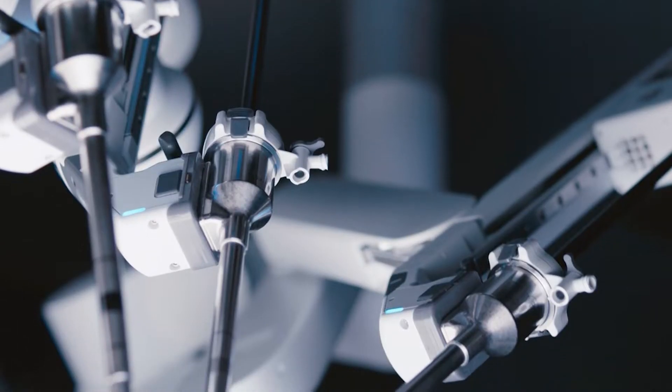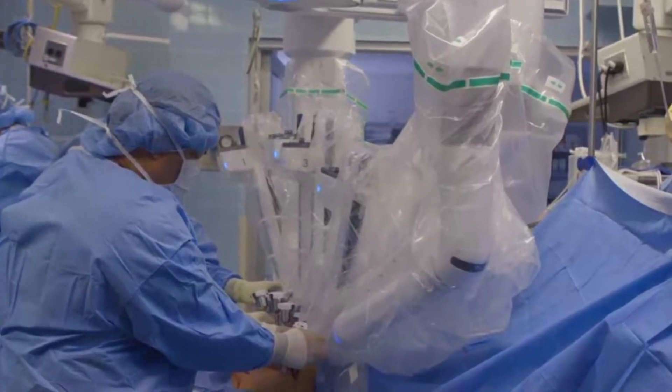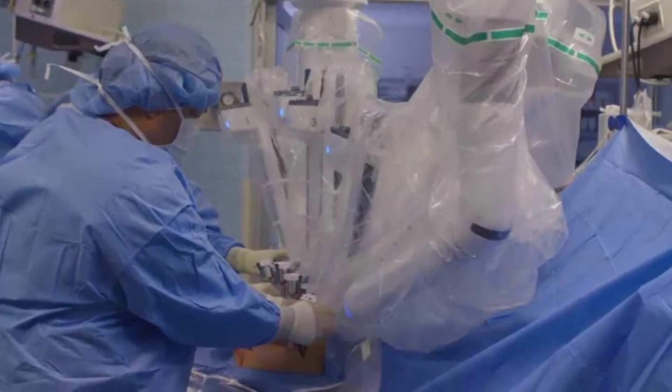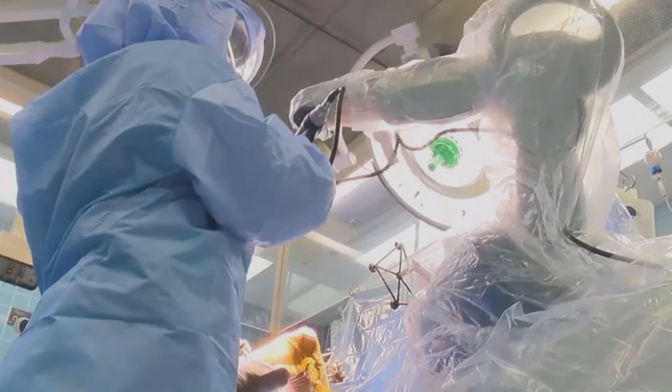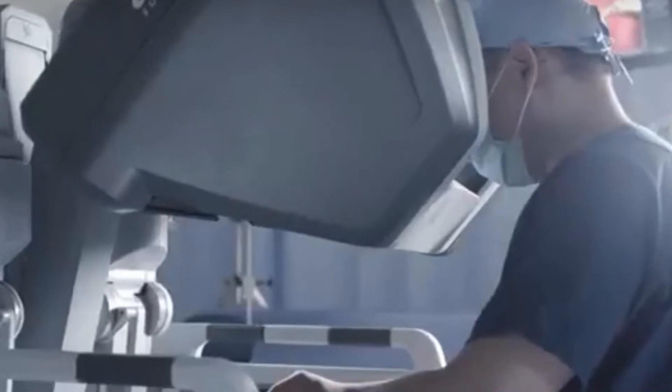The underlying motivation for this research is to improve medical care, improve surgical care for everybody. Right now, a lot of the robotic devices being developed have a person sort of operating a marionette like a puppet, and it's only as good as the surgeon who's operating.